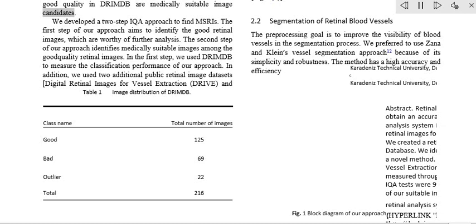We inverted the gray level values of the green channel data to improve the visibility of blood vessels. Then, we stretched the contrast of the inverted green channel image. Given that the concavity of the posterior pole causes intensity variations in retinal images, we applied contrast-limited adaptive histogram equalization, CLAHE, 11 to adjust the intensity distribution uniformity of the retinal image, Fig 2b.